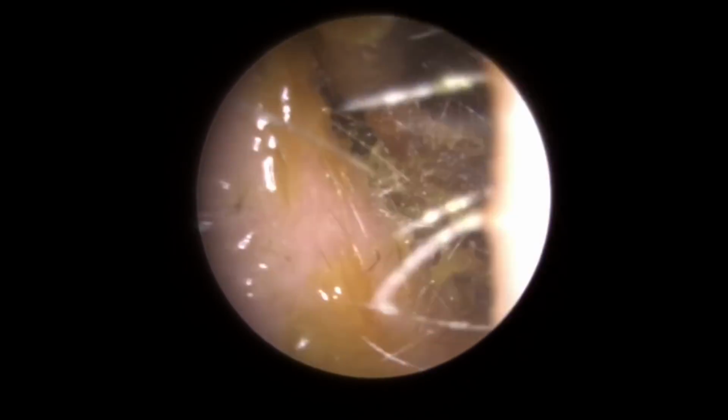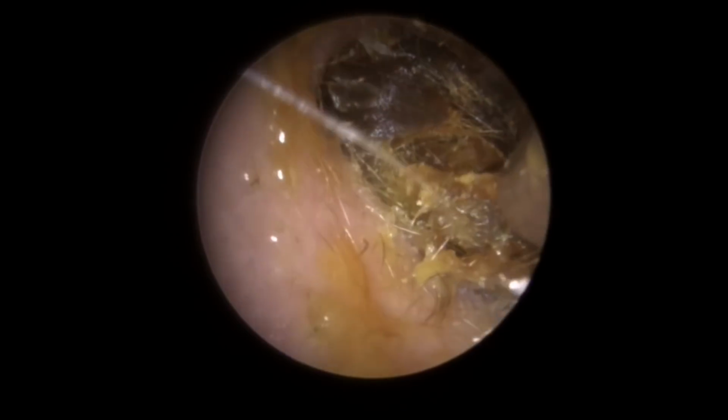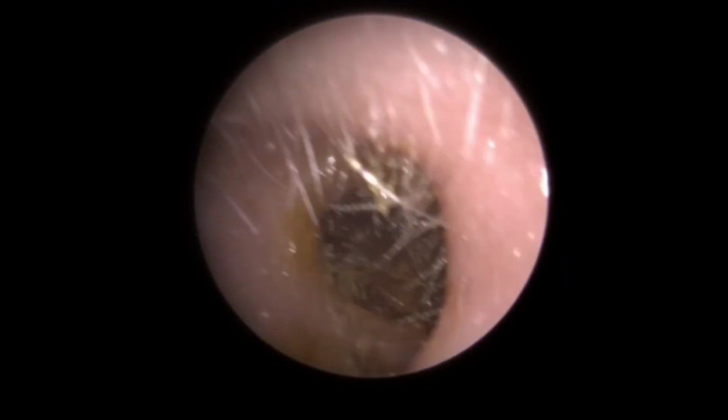There we are, just working on the top left hand corner. Just opened a little gap at this, that's what I'm aiming for with the Jobson horn now. And as we push down, you'll see it's created a little bit more of a gap. I can see over the top now.